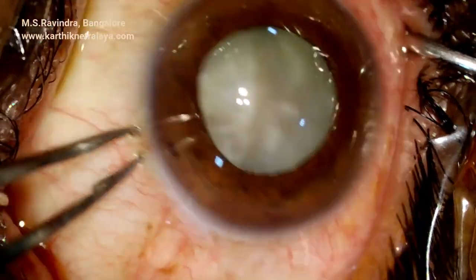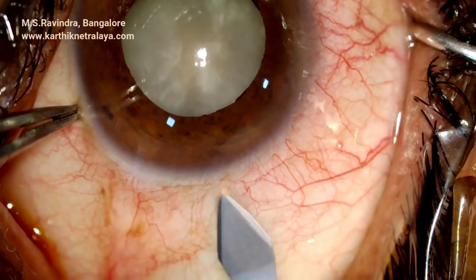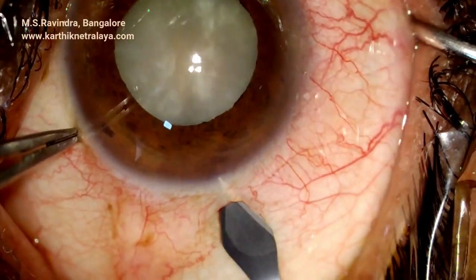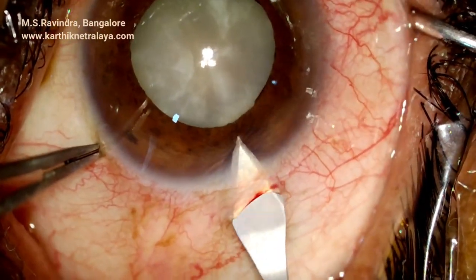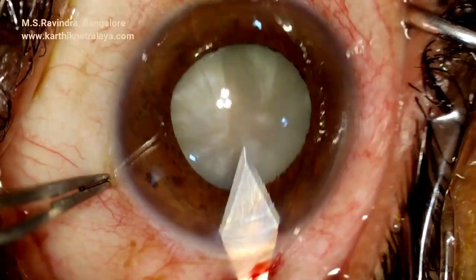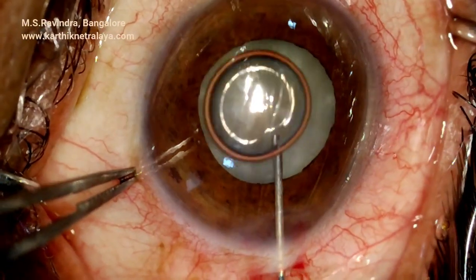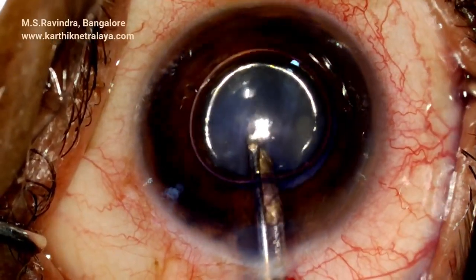A hypermature senile cataract with a very tense capsular bag. A 2.8 mm keratome at the anterior sclera goes across the limbus, enters the anterior chamber in the peripheral cornea. The globe is fixated with a 1-2 fixation forceps at the limbus.